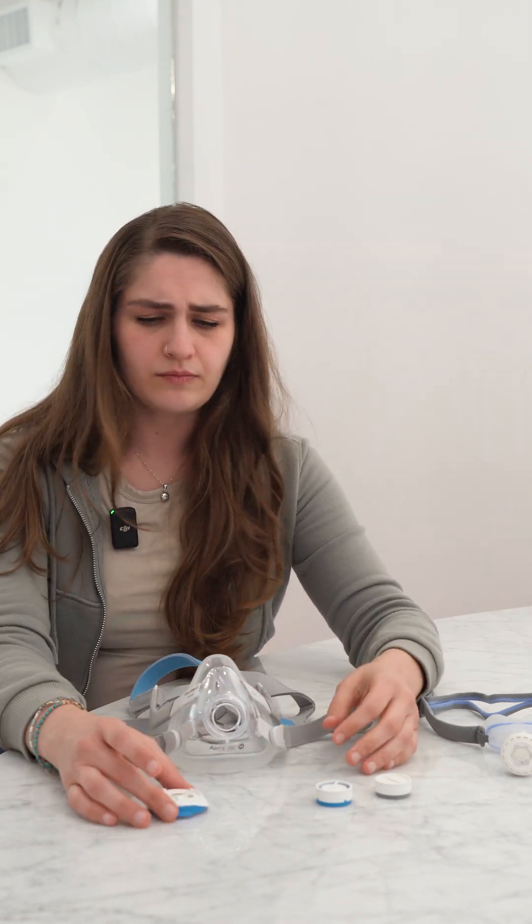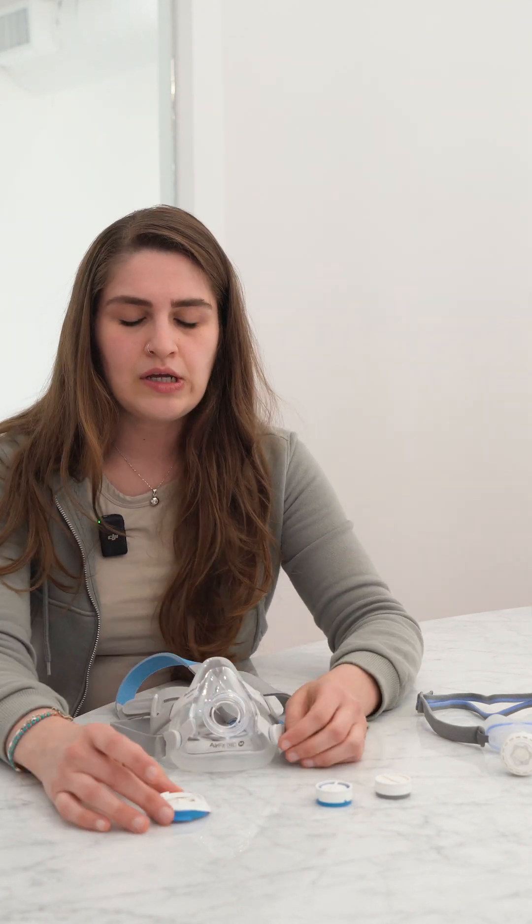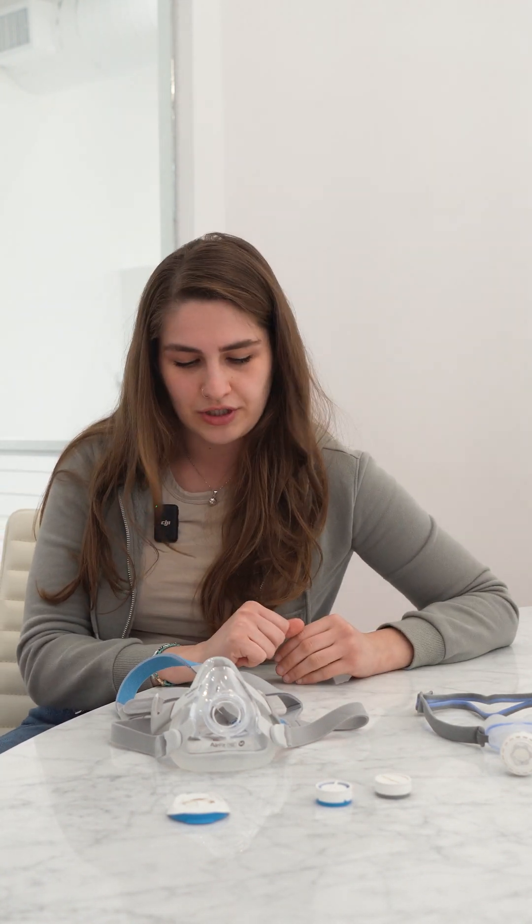These humidification cartridges actually took years to come out after the AirMini was made. The F20 full face mask never had humidification until about a year or two ago. They've been engineered over a significant period to ensure safety, and they shouldn't impact the way pressure delivery feels. If you have any questions, feel free to reach out to Lofta so we can assist you with your humidification needs for your travel device. Thanks so much everybody, take care!